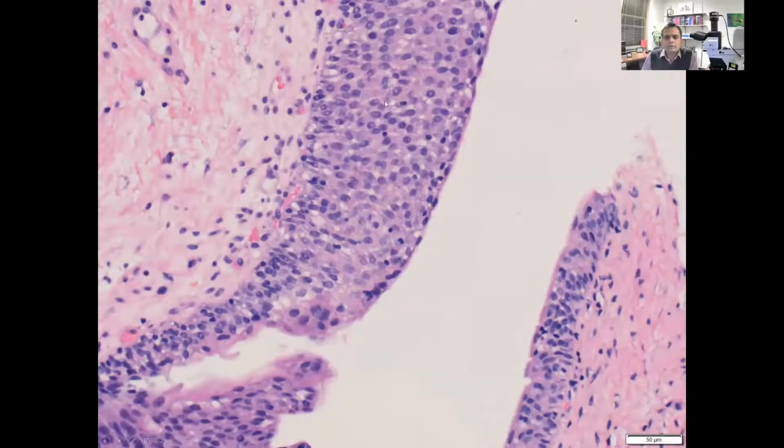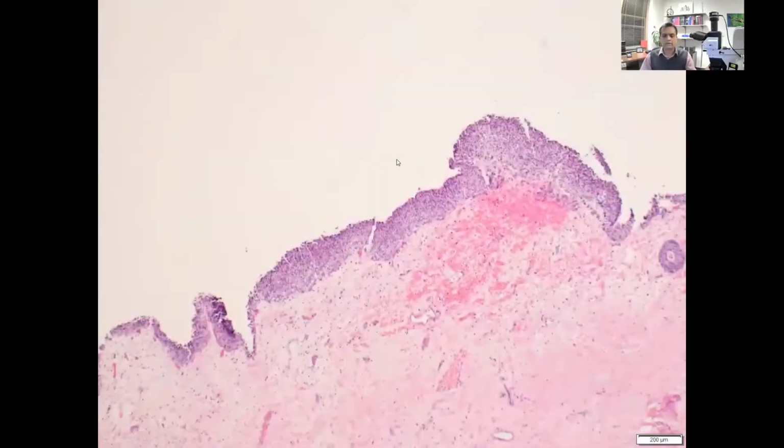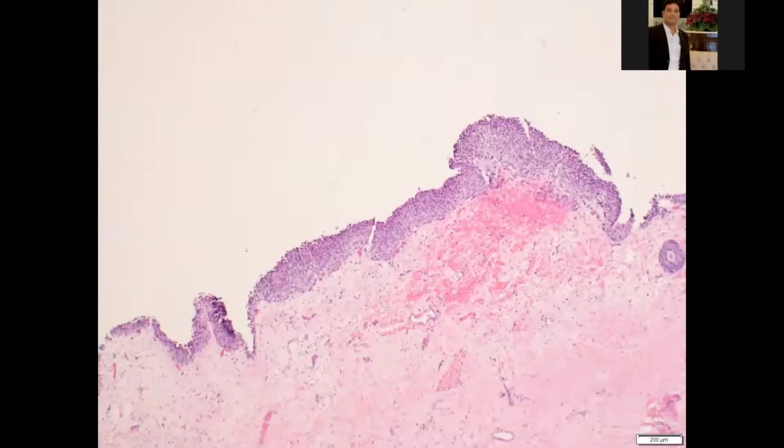If at all there is any hyperchromasia, you find it in a rare cell. Okay. And then you also can see some other examples, some variations of this theme. In this example, this proliferation has most of the same features, but in addition, you also have a little bit of undulation here, and a little bit of shallow tenting and a little bit of deeper tenting over here.